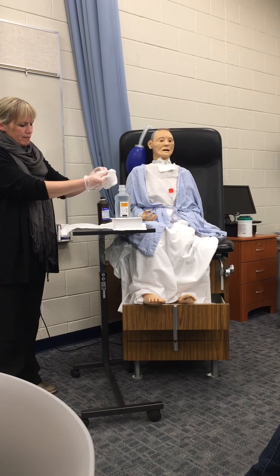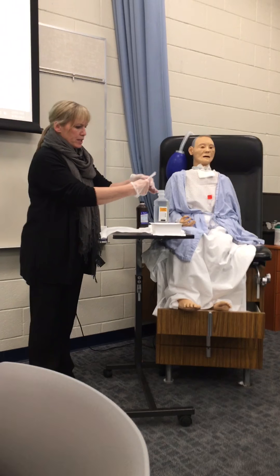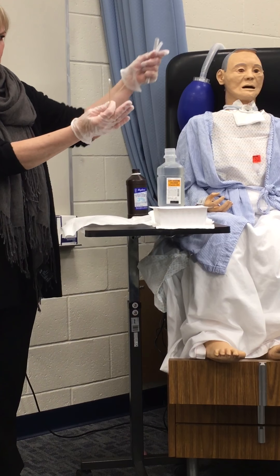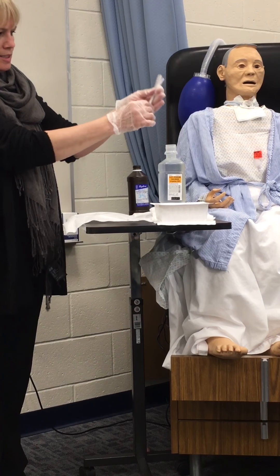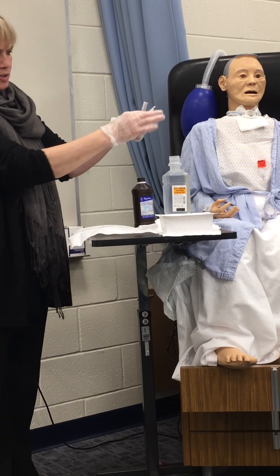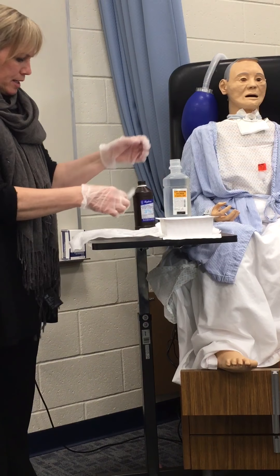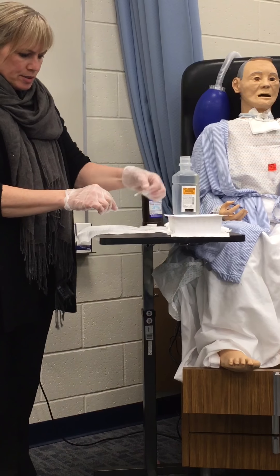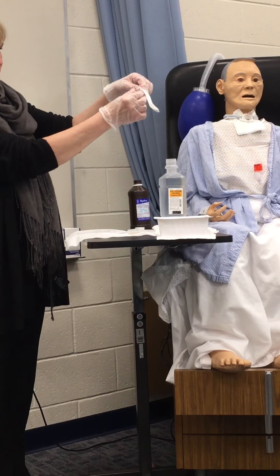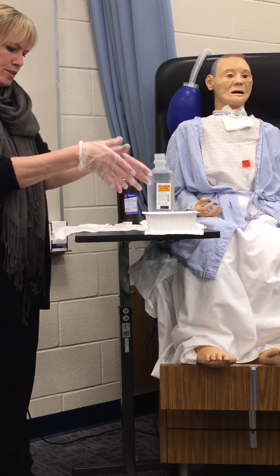You have a 4x4, and then you have that drain sponge, which is that split one like he's wearing. Just lay stuff out — you're going to have more things than you need. This is the Q-TEC, which is super tiny. That lady's inner cannula I was telling you about is like 6 or 8 inches — she would need something else. These are old-fashioned pipe cleaners, but they're really sharp, so if you're going to use them, bend them and clean around so you don't injure her skin.